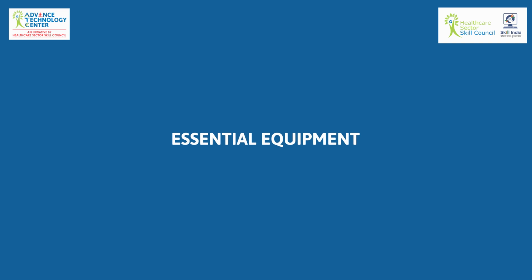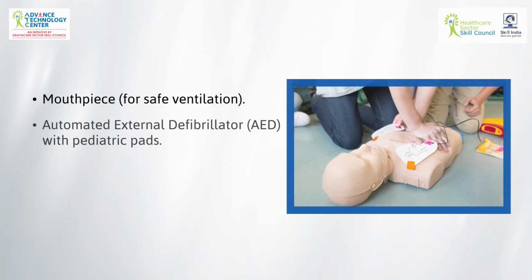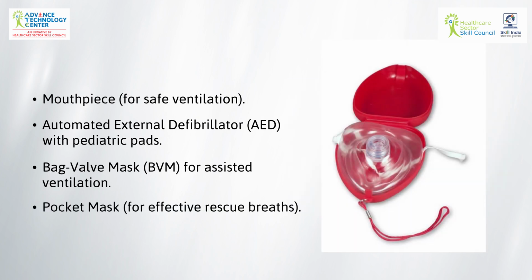Essential equipment: mouthpiece for safe ventilation, automated external defibrillator, AED with pediatric pads, bag valve mask, BVM, for assisted ventilation, pocket mask for effective rescue breaths.